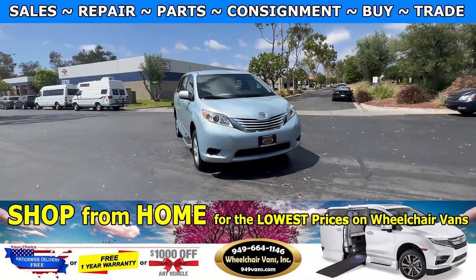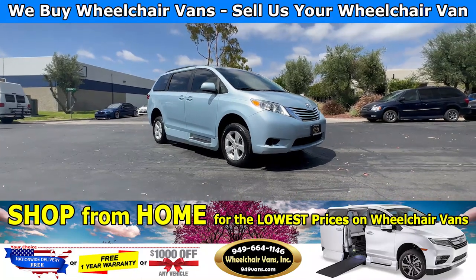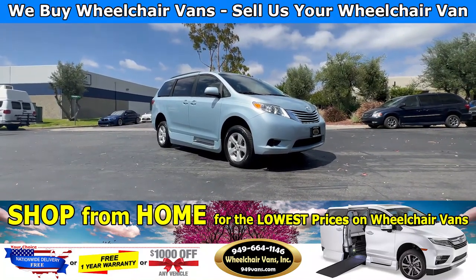Hello and welcome to Wheelchair Vans Inc. Today I will be going over a 2017 Toyota Sienna with the AMS conversion by VMI.